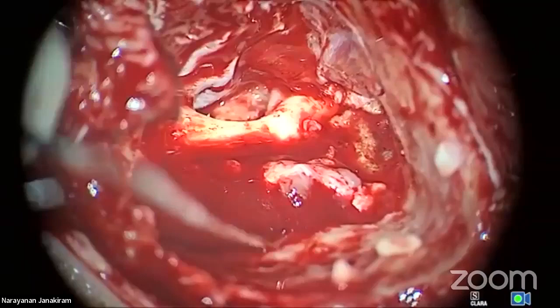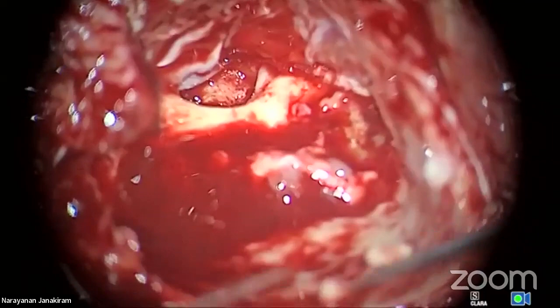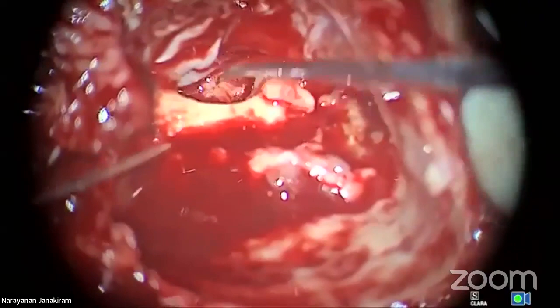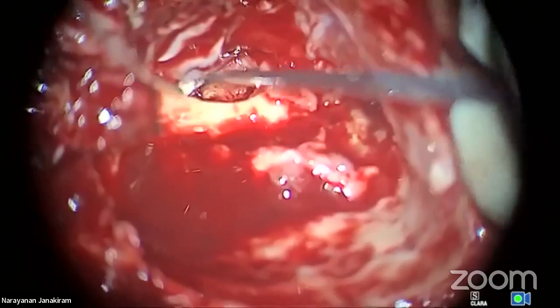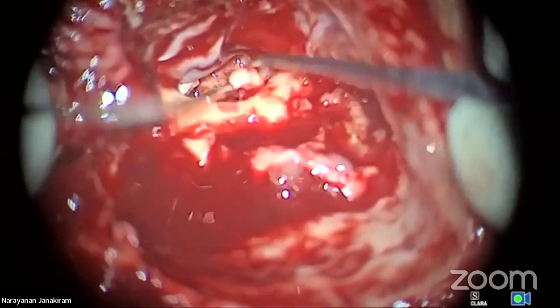Okay. Now, the first cartilage which I'm going to place is to augment the middle ear space. How do I do that? Now, this is for the stapes. See here, you keep it in the hypotympanum like this. It's just a cartilage palisade, not to close the round window niche. This is just to augment the height. This is called the stabilization cartilage. This is the actual strut for the stapes.